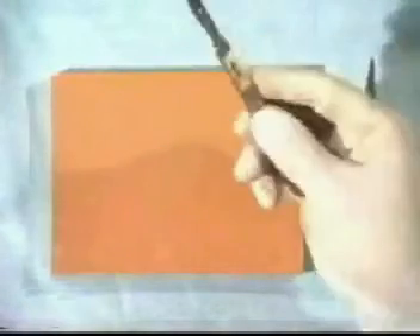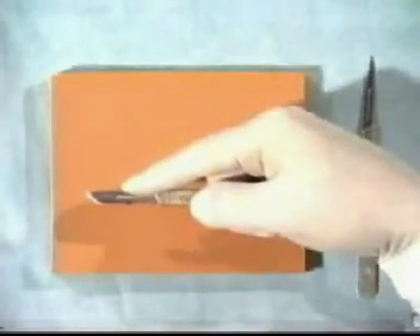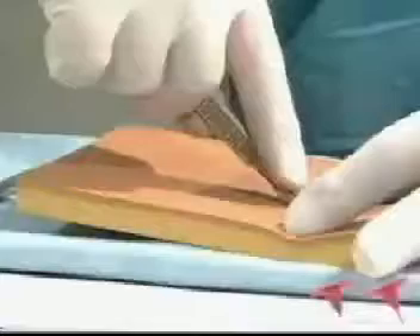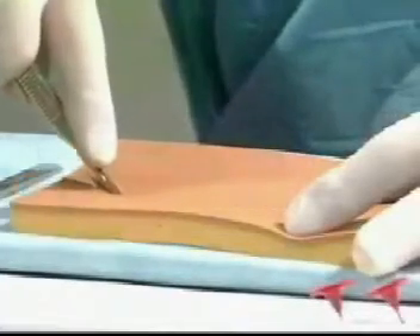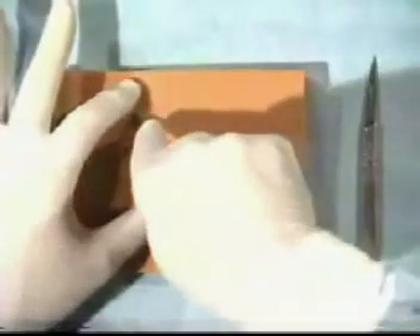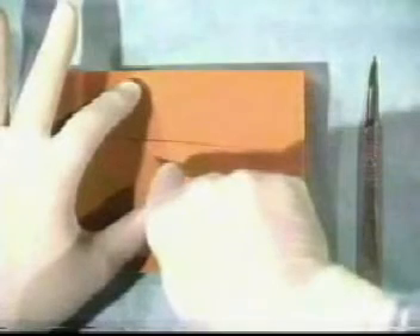Instead, handle the scalpel in this manner, using your index finger to steady it. You can then draw it gently and carefully across the skin in a controlled manner, as demonstrated. Never ever cut towards your own fingers or thumb, as it may not just be the patient that you cut.